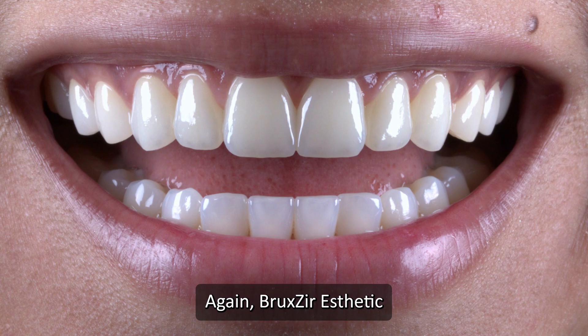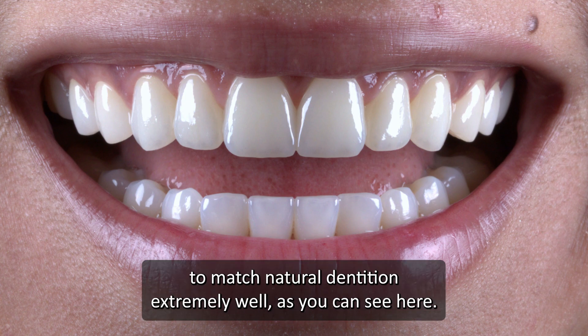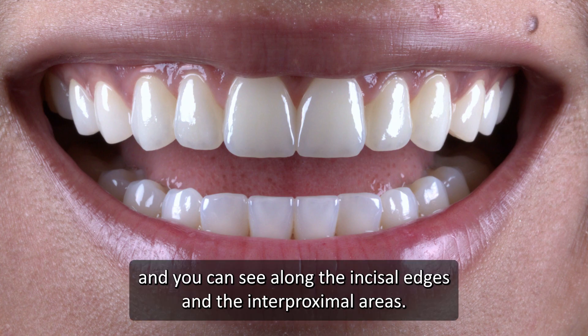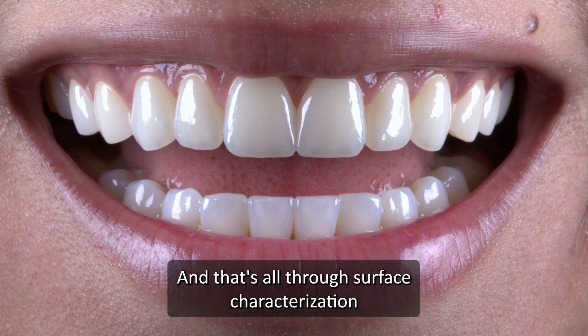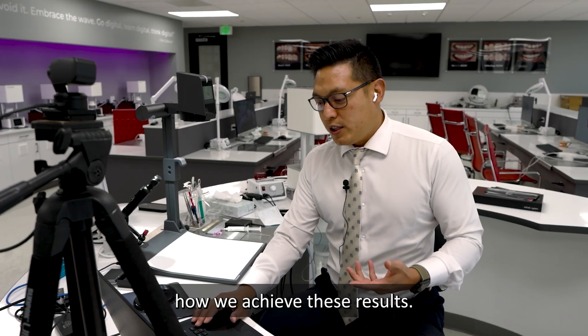BruxZir Esthetic is a translucent enough material to match natural dentition extremely well, as you can see here. These are from the mill, and you can see along the incisal edges and the interproximal areas we have that hint of blue, a little bit of gray. And that's all through surface characterization — what we normally term as stain and glaze. That's my goal for today: to take you through how we achieve these results.